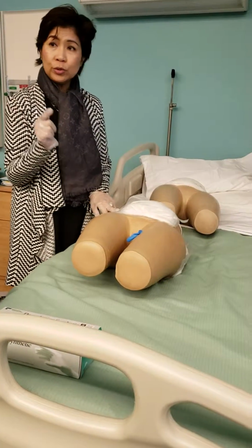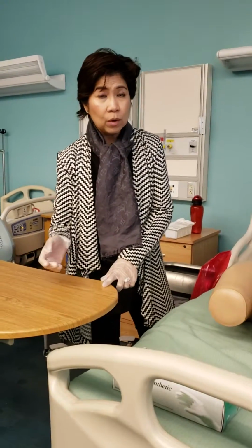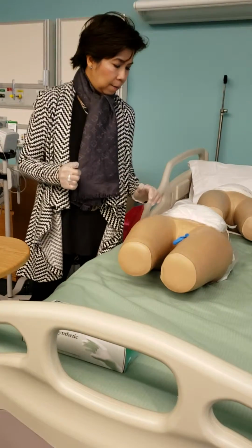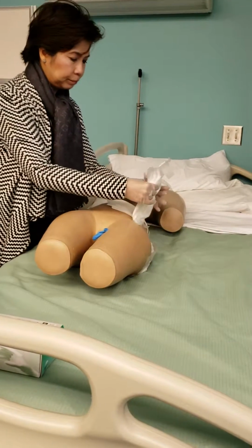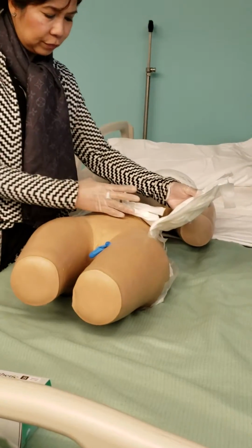So make sure when you do your checkoff, cut a piece of tape, put your initial and the date. You can put the time if you want, because there might be orders where you are doing dressing twice a day. So you want to check that you're doing it twice a day. So I open my dressing. This is my Penrose one, and this is my suture one. Let's do the suture first.